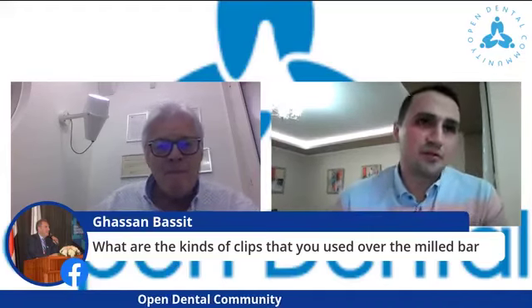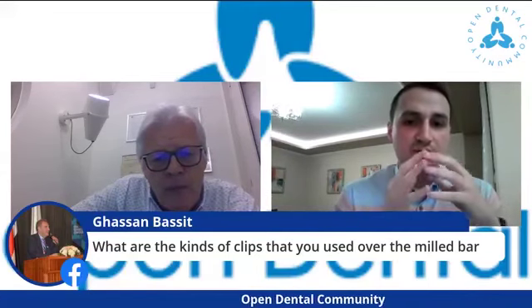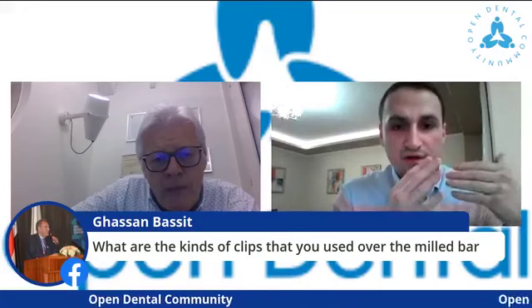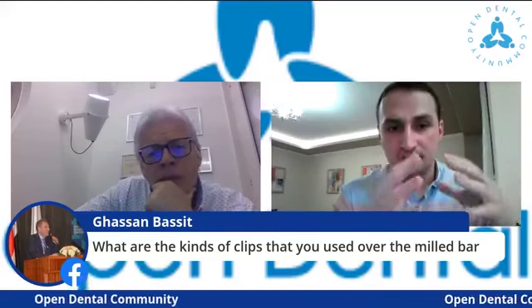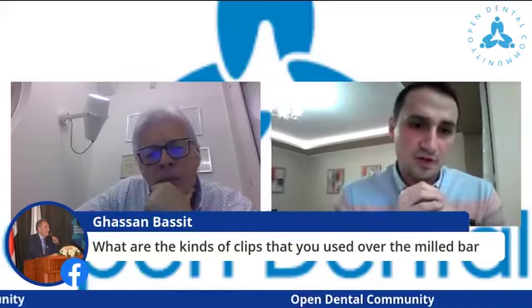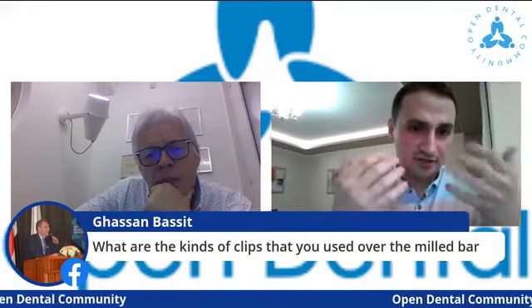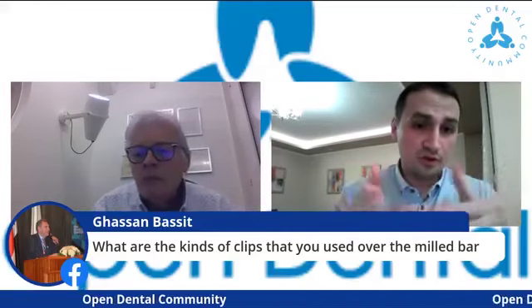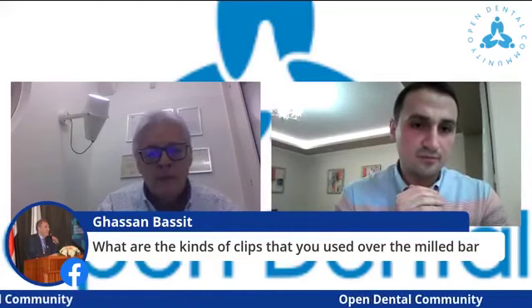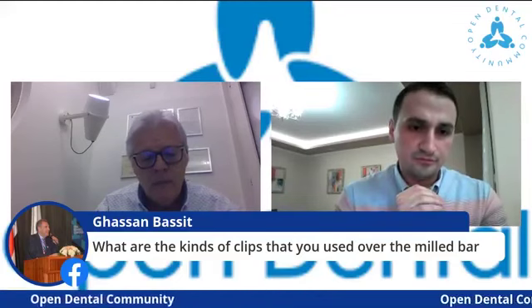Yes, everything depends on the situation. As I said, firstly, we must achieve very important requirements for immediate loading. To be honest, I always prefer delayed loading after 4 months. But everything depends on the patient's medical and health situation, the quality of the bone, the number of implants, and the torque that we are achieving while inserting the implants. A lot of factors are included in the decision.